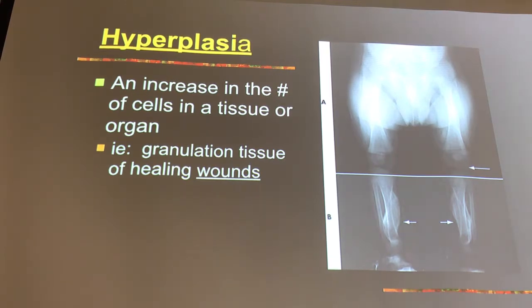So when you think about this, what color is your image if you didn't do anything? If you just processed the plate and didn't expose it, what color is it? Okay, you have a 50-50 chance, and that ain't the right 50. White. It's white, correct?